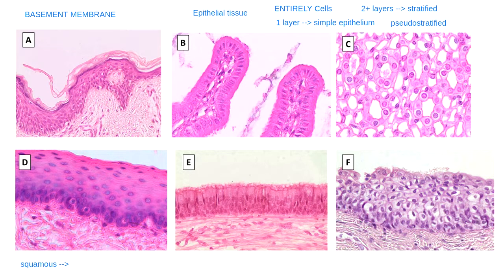So when you think of a squamous cell, you're going to see cells that are pretty flat. They're going to have a dark spot in the middle. That's the nucleus. Sometimes we say they kind of look like a fried egg when we're looking at these ones up here on the top. So when we talk about squamous shaped cells, they're really flat. They're really skinny. They're squished or squashed, if you want to think about that with their name. Next shape word that I have is the word cuboidal.